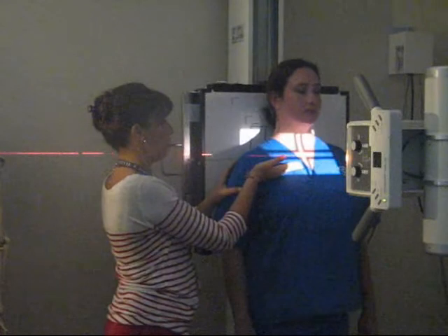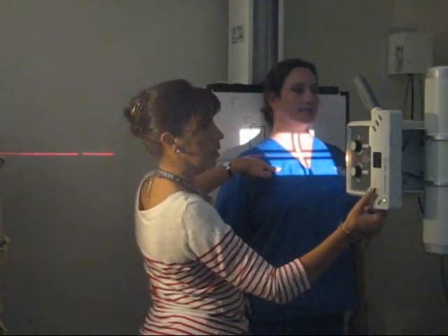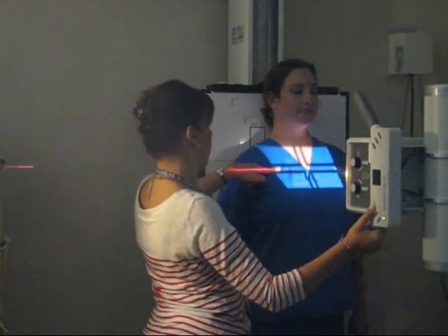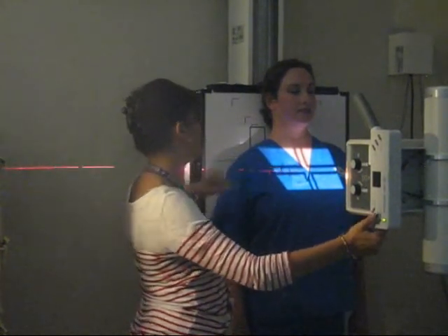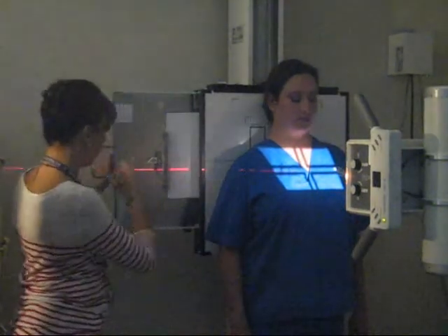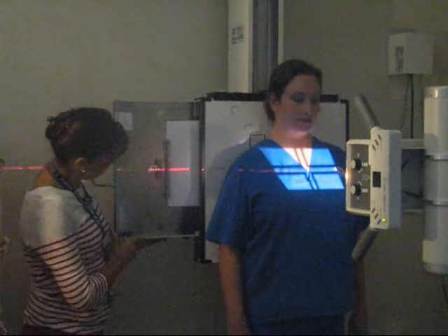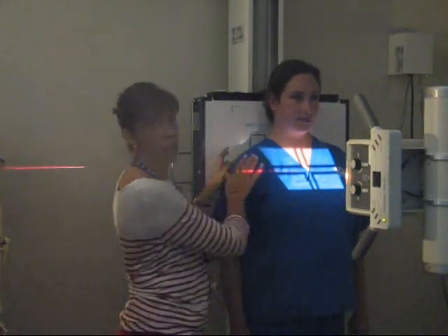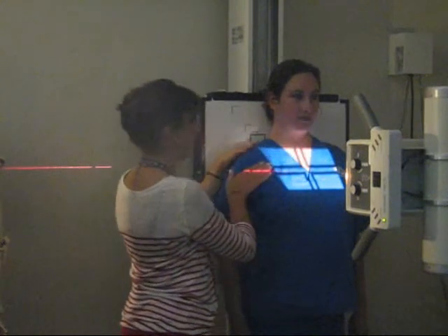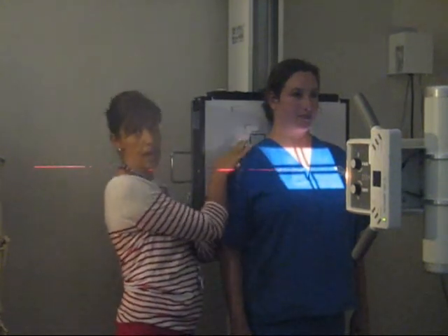Okay, bring your patient back down straight and bring your CR down to about where you figured out you have your mid scapula. Adjust your film. So you are centered, and now all you have to do is adjust your patient. And as you can tell, your scapula is not in the middle, it's closest to the side.